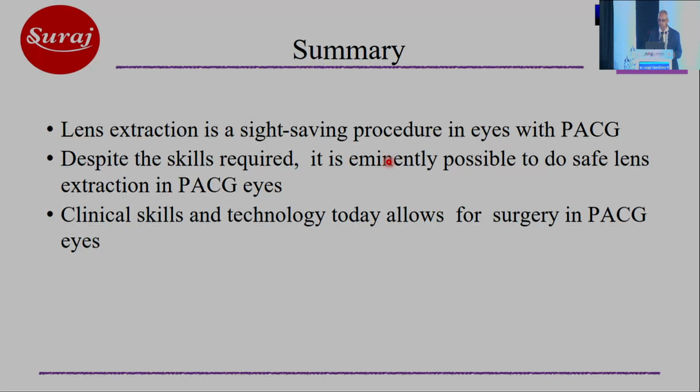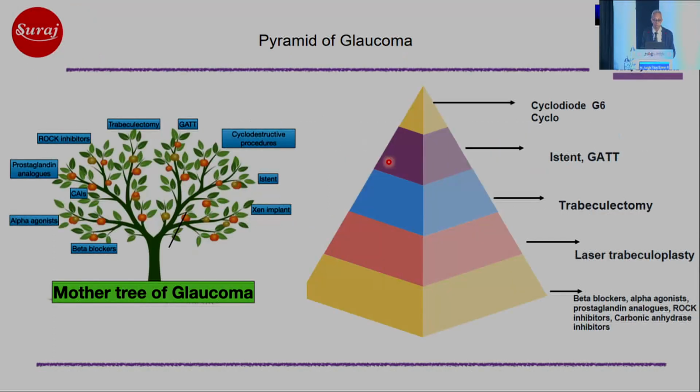Clinical skills and technology today allow for surgery in eyes with primary angle closure glaucoma. And this is a pyramid that I keep on showing just to tell you how we have evolved and what are the opportunities that are available for us.